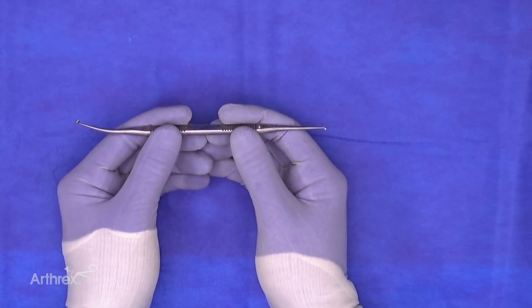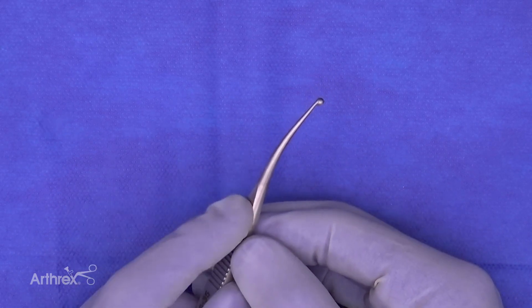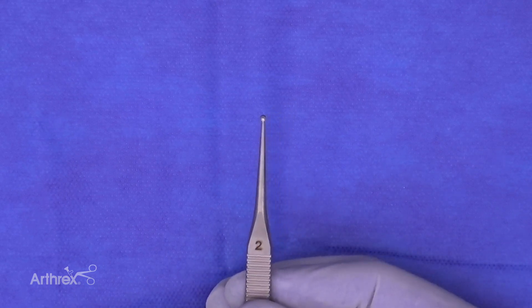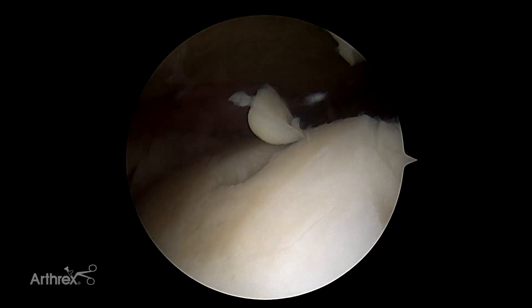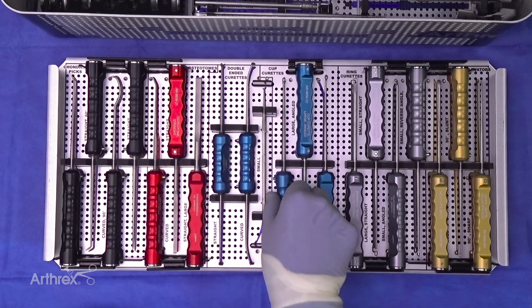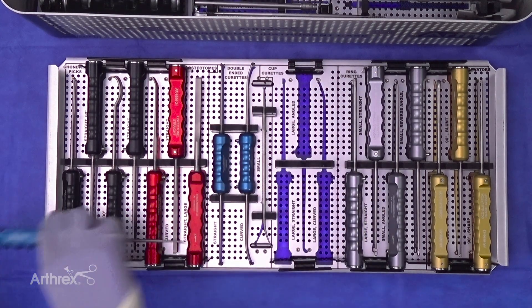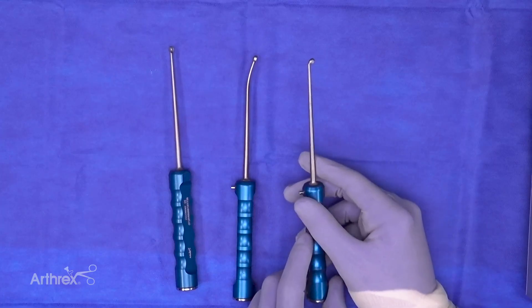We also have a small double-ended cup curette for fine-tuning smaller defects. One side is a 3mm curved cup curette and the other is a 2mm straight — surgeons can even use this at the MTP joints or any joints around the midfoot. The remaining curettes are more self-explanatory: a large straight cup curette, a curved version, and a straight with a down-curve to help in the posterior aspect of the talus.